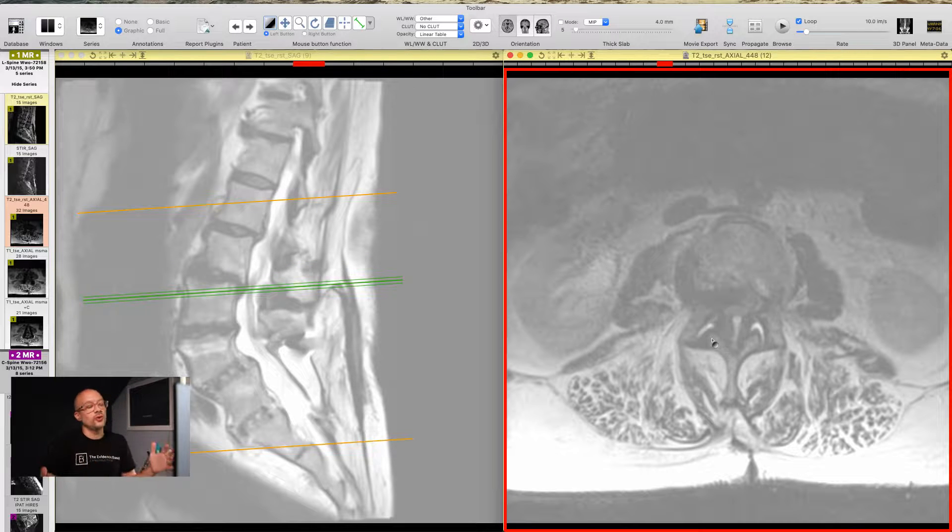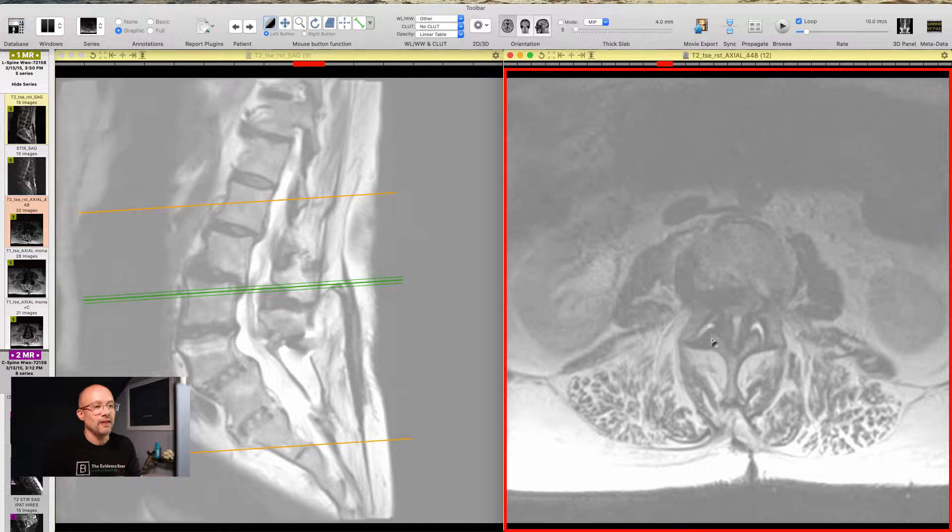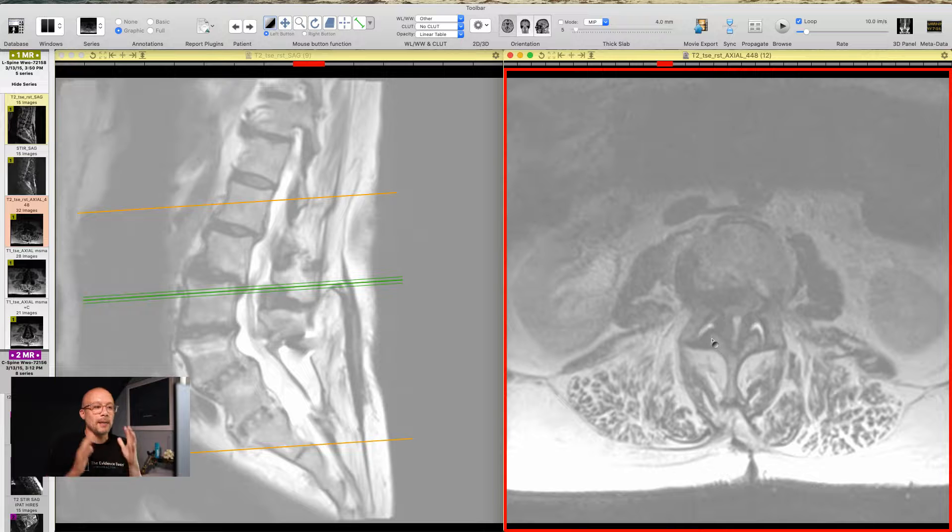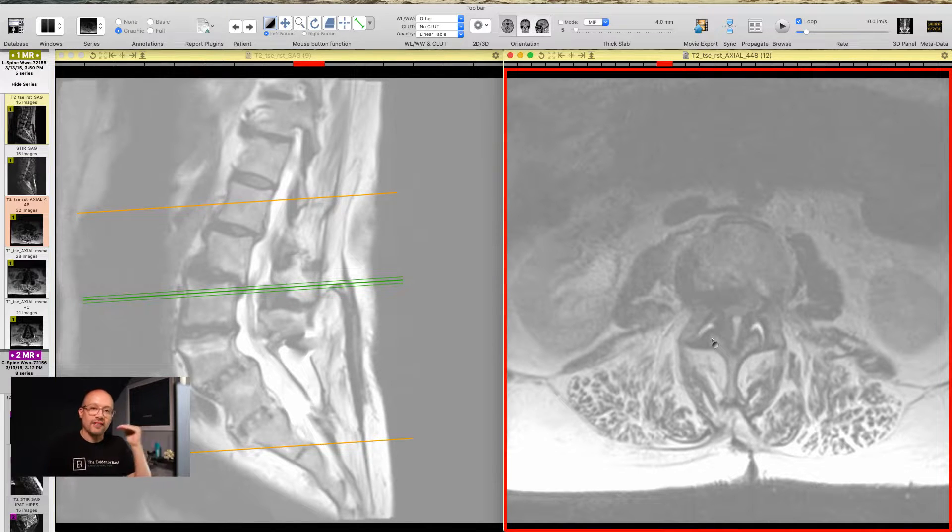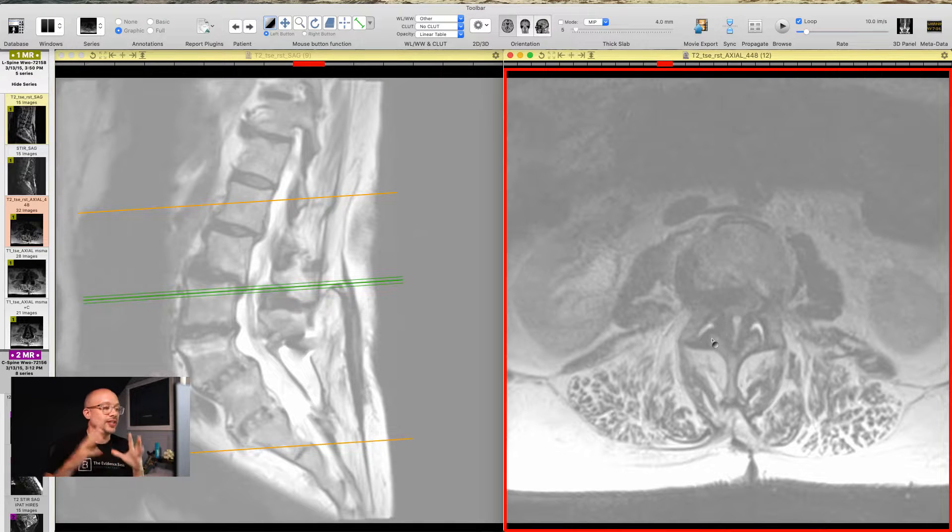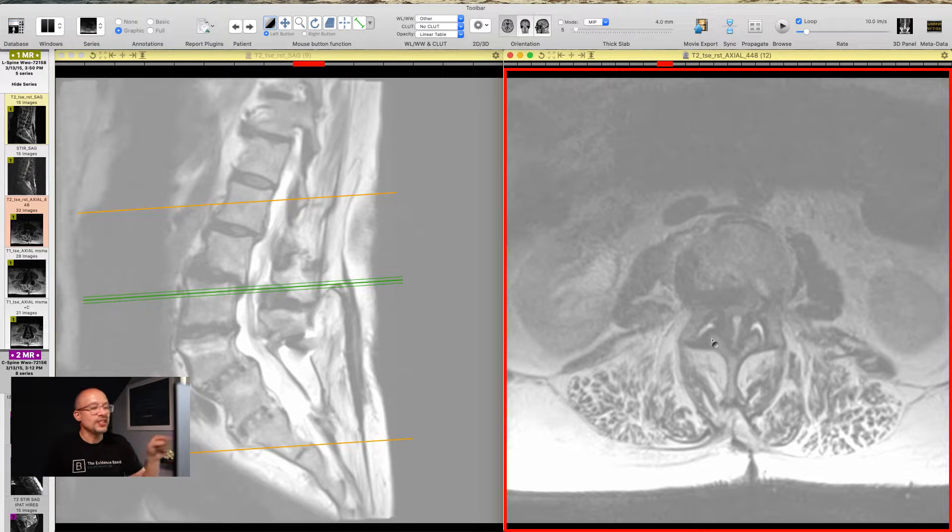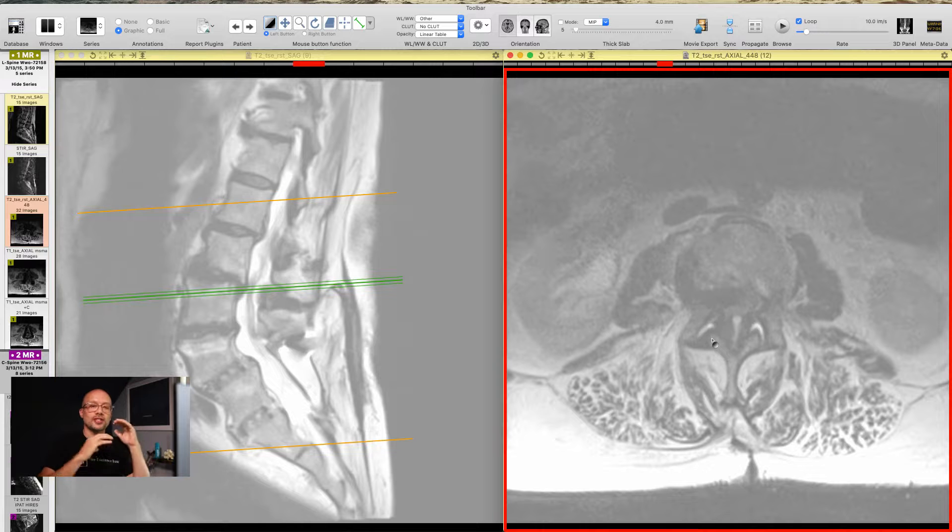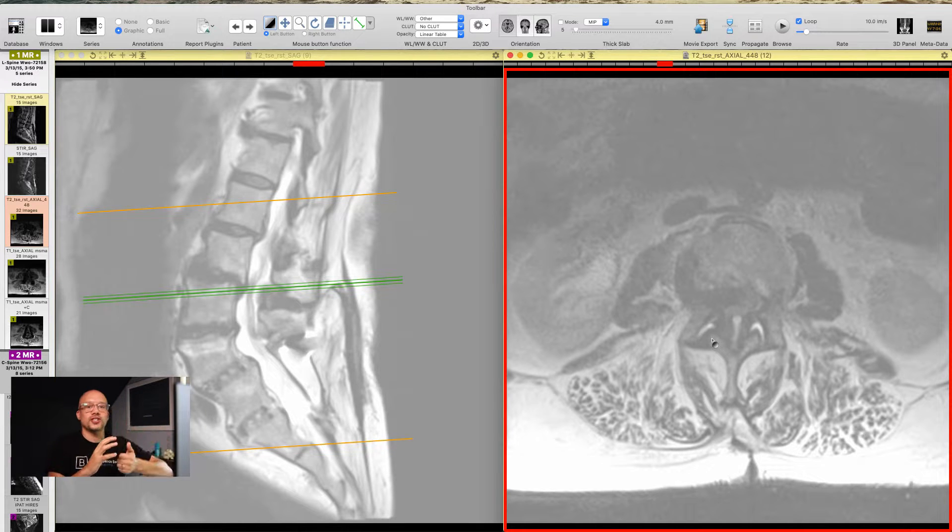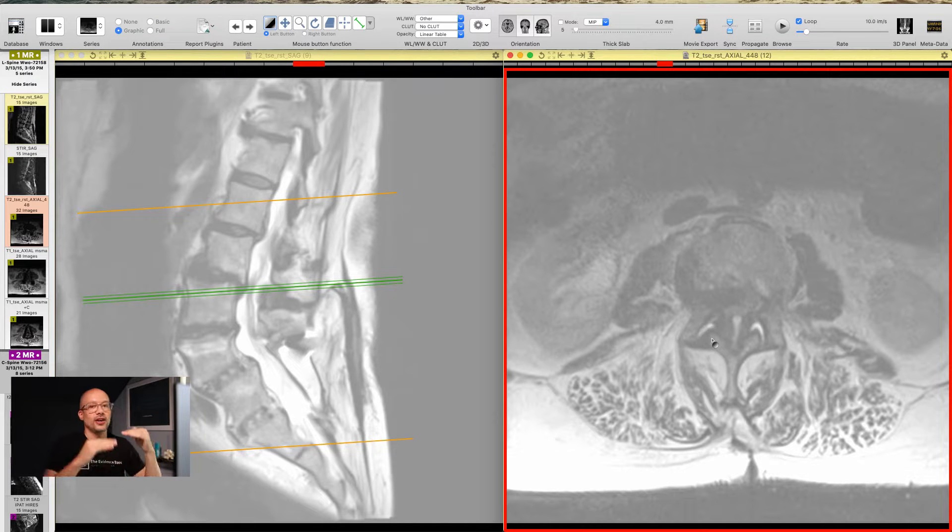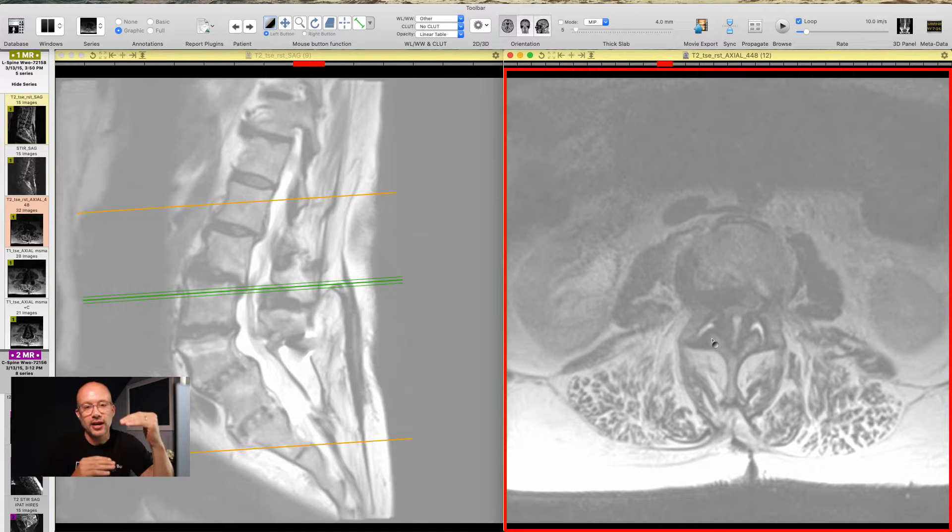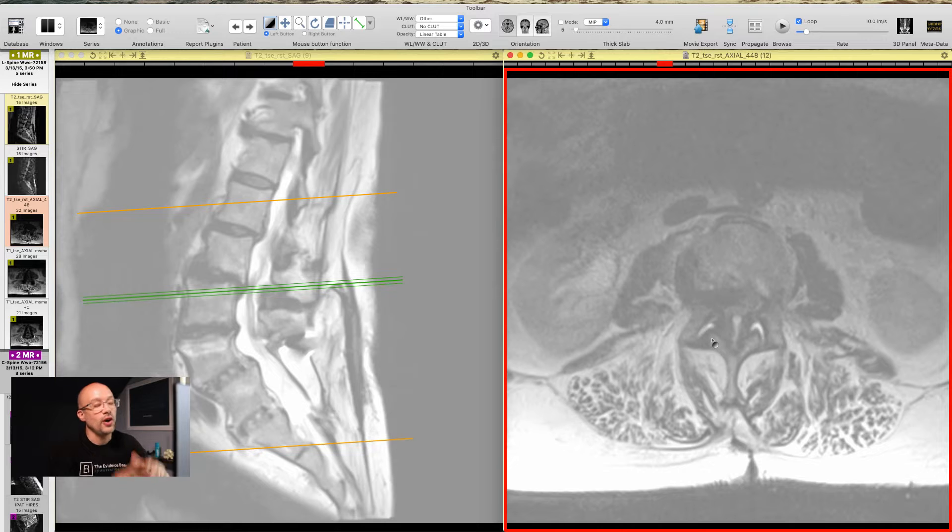So this individual, they have probably had previous back pain for a long period of time because we can clearly see that this individual had a multi-level fusion. Now with that fusion, unfortunately, it's L4-L5-S1. With that fusion, it resulted in a pretty large fluid collection, which might not be the source of the issue, but we can see up above how there's that cascade effect. When you start to stabilize and secure and fuse one level, it puts additional stress and strain on the levels above. That's exactly what's happening right here. We see at L3-L4, and more importantly L2-L3, a huge pinch or compression on the spinal cord.